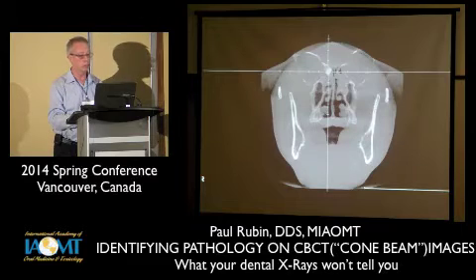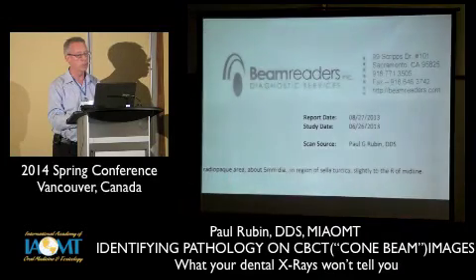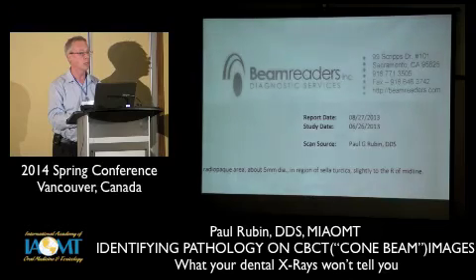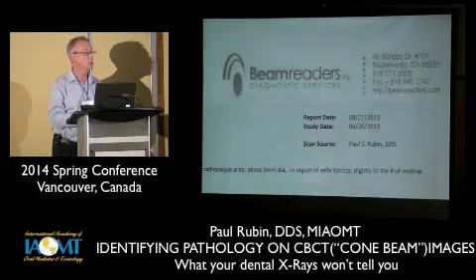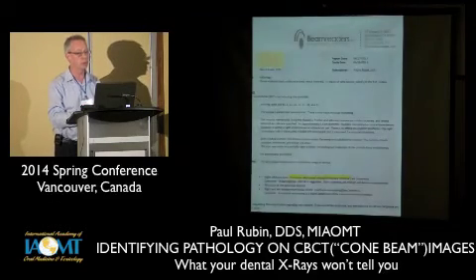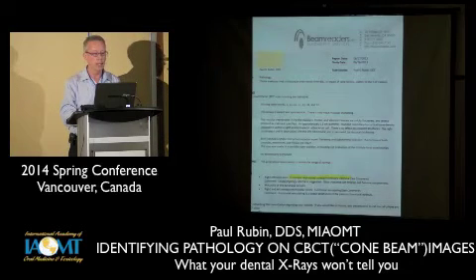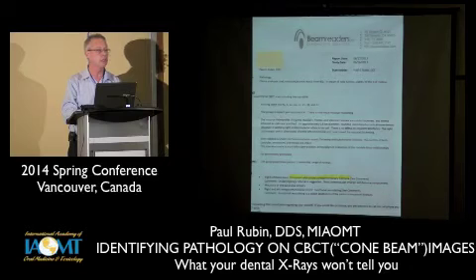Or if you see a spot like this that you don't know what this specific thing is, you can send this off. There's a service called Beam Readers, is one of them. There are others out there. And you send them the images, you send them information of what you're seeing and ask them for a report, and you'll get a report back like this. And I think it costs maybe $100. I know some dentists are routinely, on almost every image, sending it to a radiologist to cover themselves medical legally.